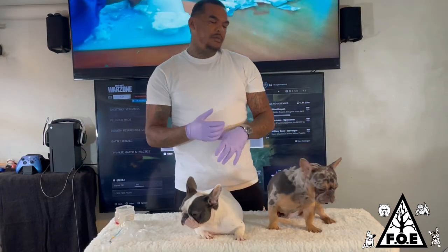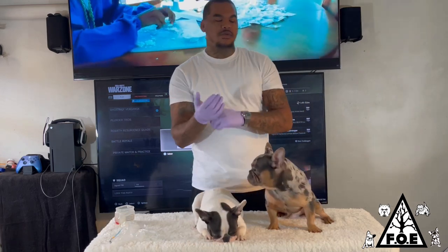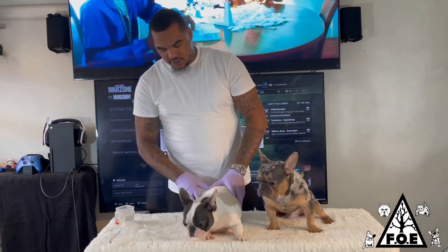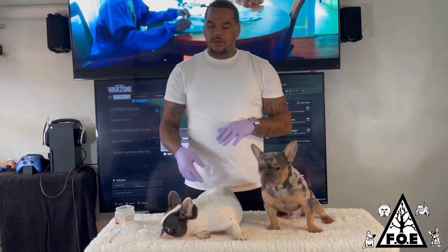Now that we're done with him, normally the process takes about 15 to 20 minutes, sometimes more depending on the dog. So I just switch it right over to her. Now we're going to show you how to take it and put it into the female.